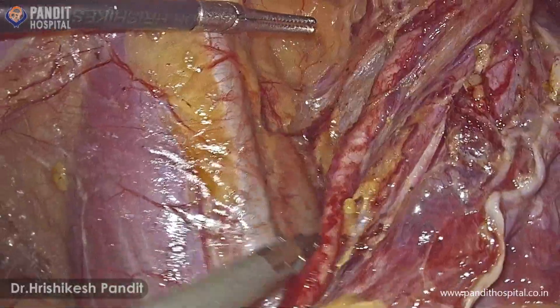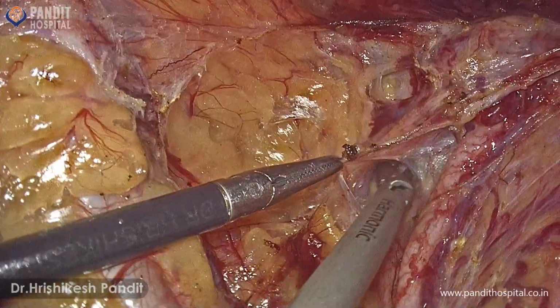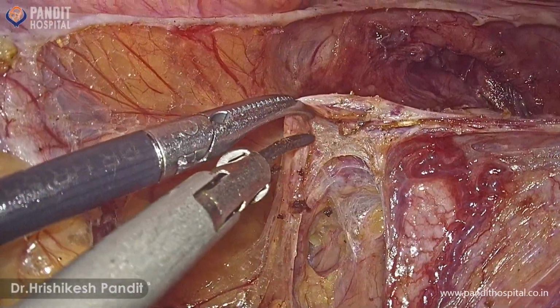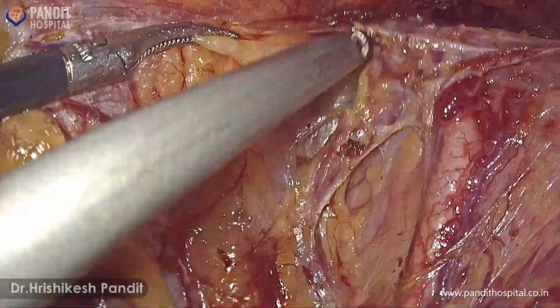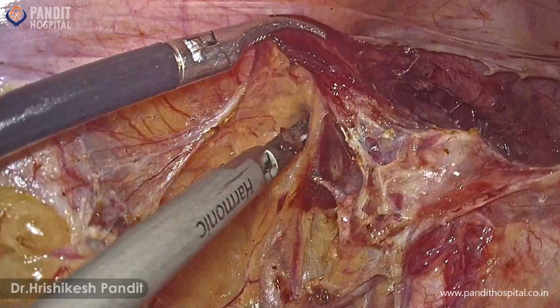Now we dissect along the internal iliac artery to see it giving off its first branch, that is the uterine artery. Make a note that the uterine vein runs caudal and along the uterine artery. Uterine artery and deep uterine vein form a fork and the ureter is sandwiched between the two.